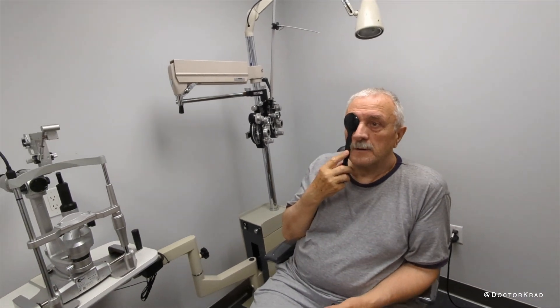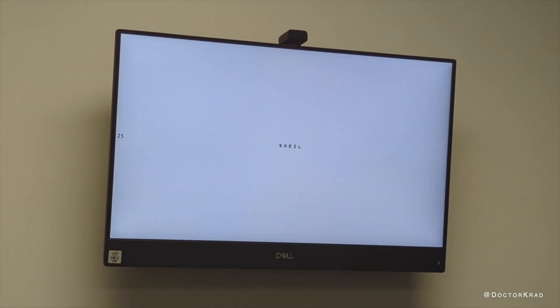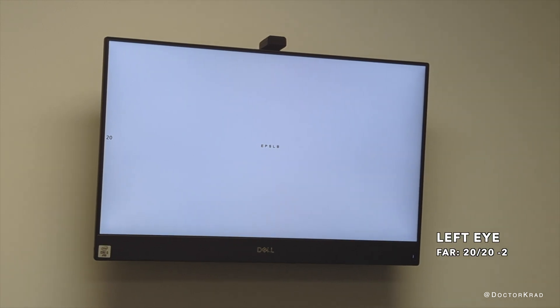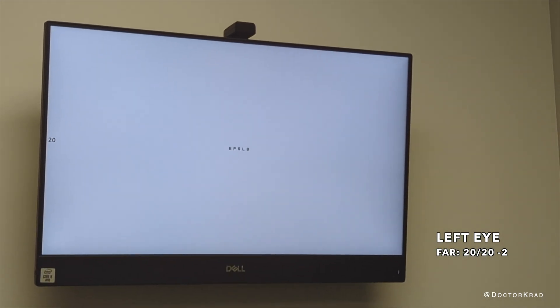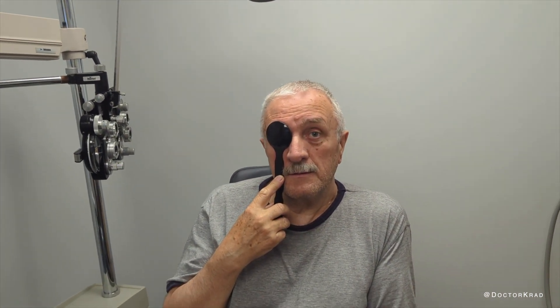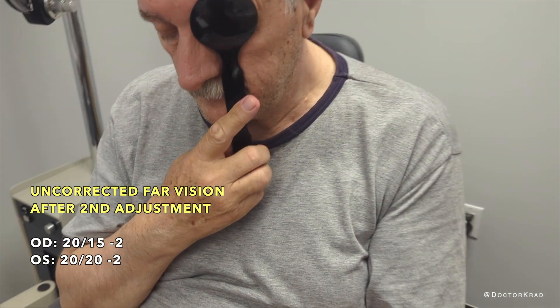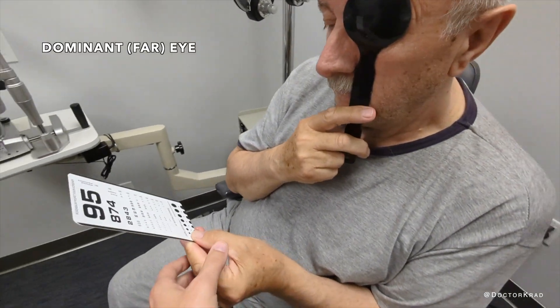Now cover the other side — cover the right eye. This is the one we made for near. I'm going to make it a little bit bigger. So try to read that for me. So these are three out of five — this is the near eye. Now we're going to have a reading card. Cover your left eye and hold this — this is your distance eye. Right around there.